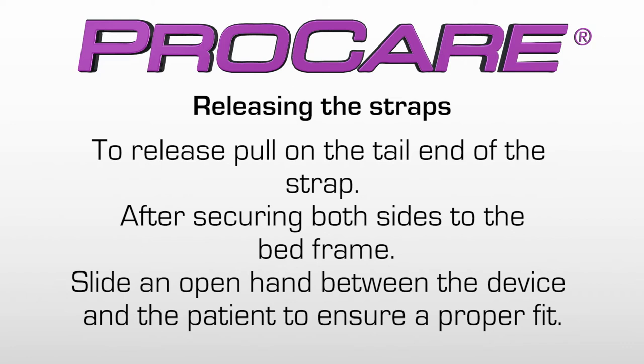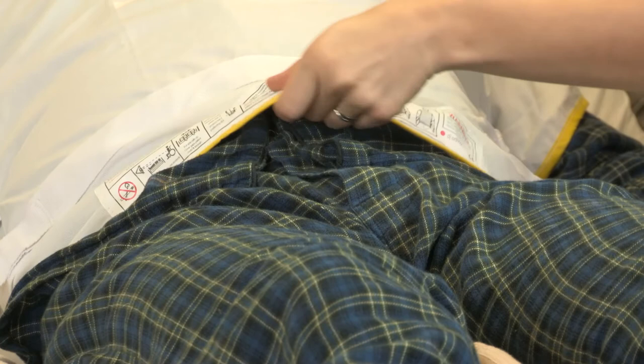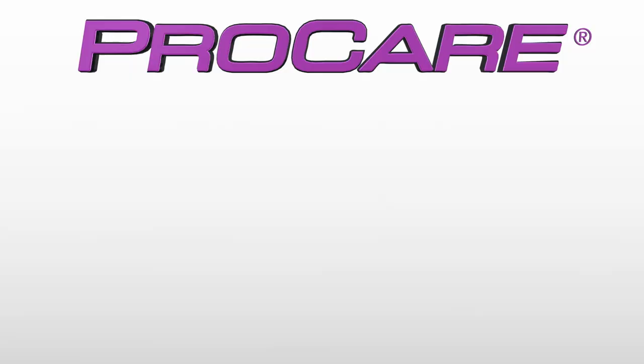To release, pull on the tail end of the strap. After securing both sides to the bed frame, slide an open hand between the device and the patient to ensure a proper fit.